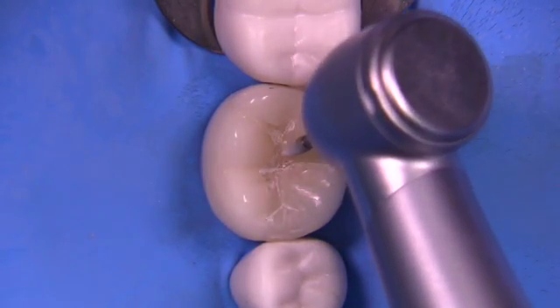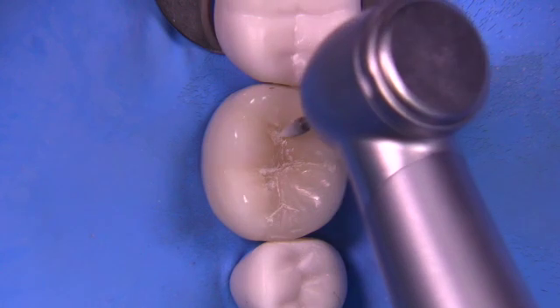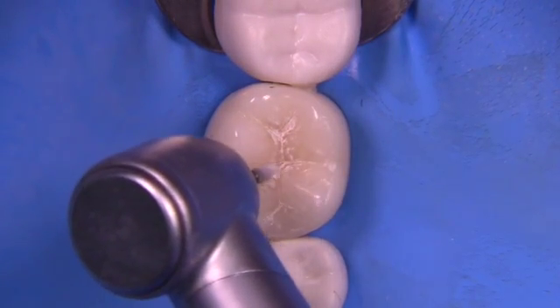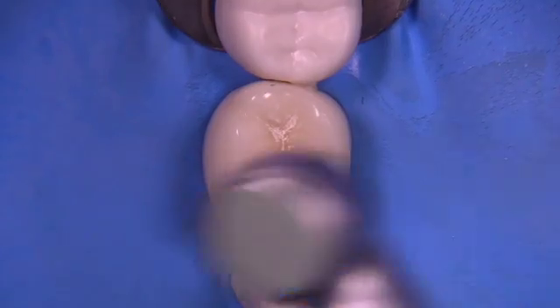A light touch. This is on high speed but I'm not turning the high speed up to maximum RPM — I'm utilizing it a little bit slower. You can certainly use a slow speed on an electric handpiece. If you're going to use an electric handpiece, probably about 20,000 to 30,000 RPM would be good.